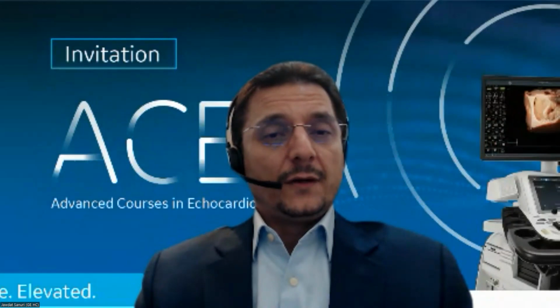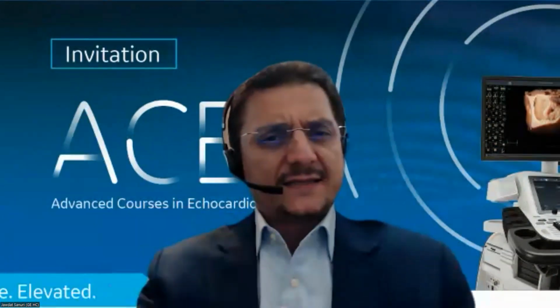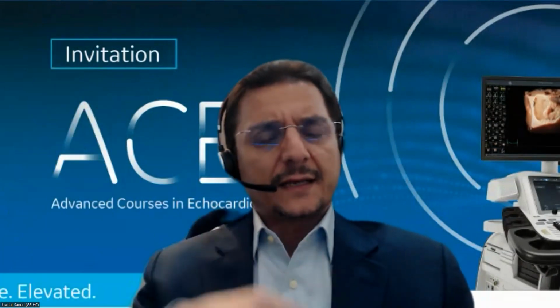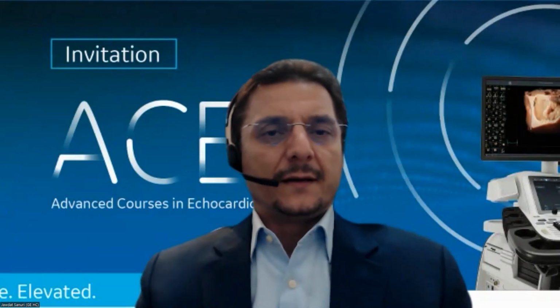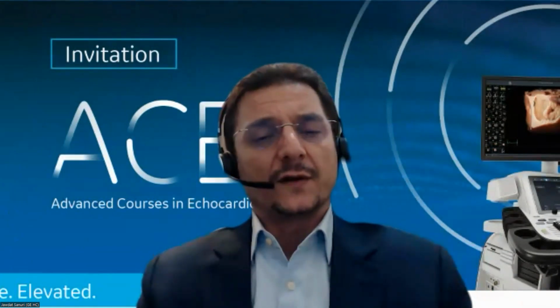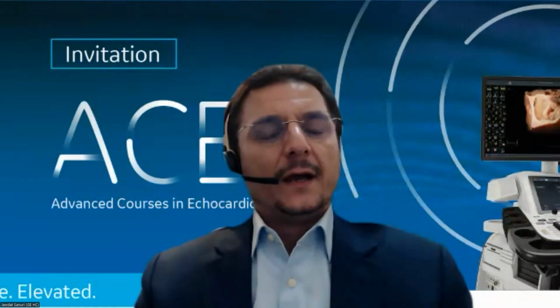Like I said, the color setting and the preset is actually called coronary flow. It is in the quick apps, so you don't have to change the preset. It is an icon symbol of a thunder, or an electric current, let's say. You can select that and have the coronary preset or sub preset without losing the geometry, the depth or the width of the image that you have selected, or the zooming, which was already specific to a certain view.